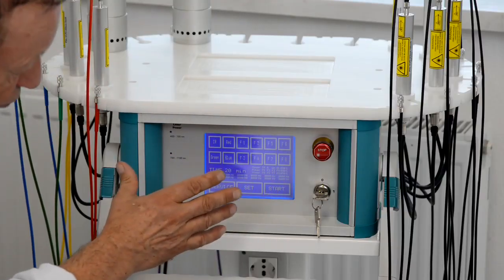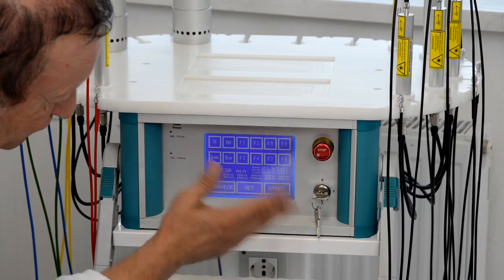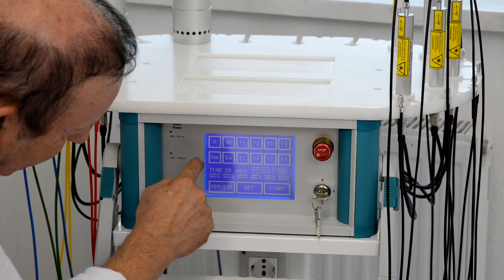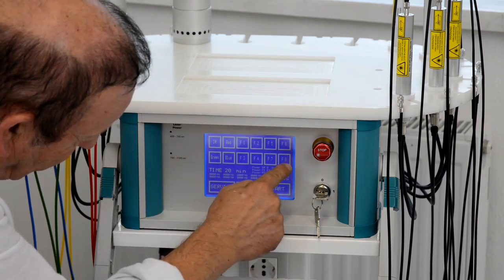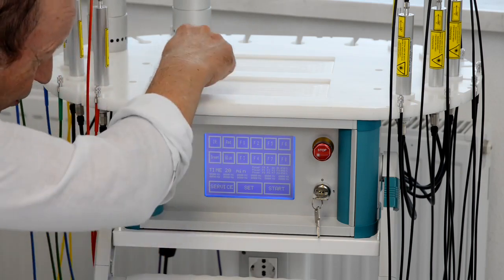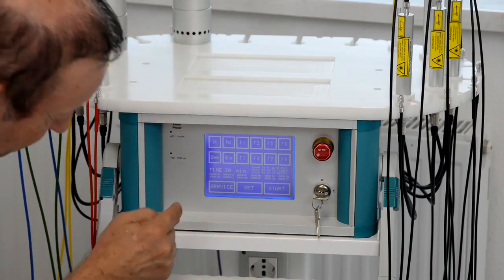So now let's have a look at the display after switching the device on. You see in total 12 channels on the touchscreen display, which is according to the plug-ins on the back side.